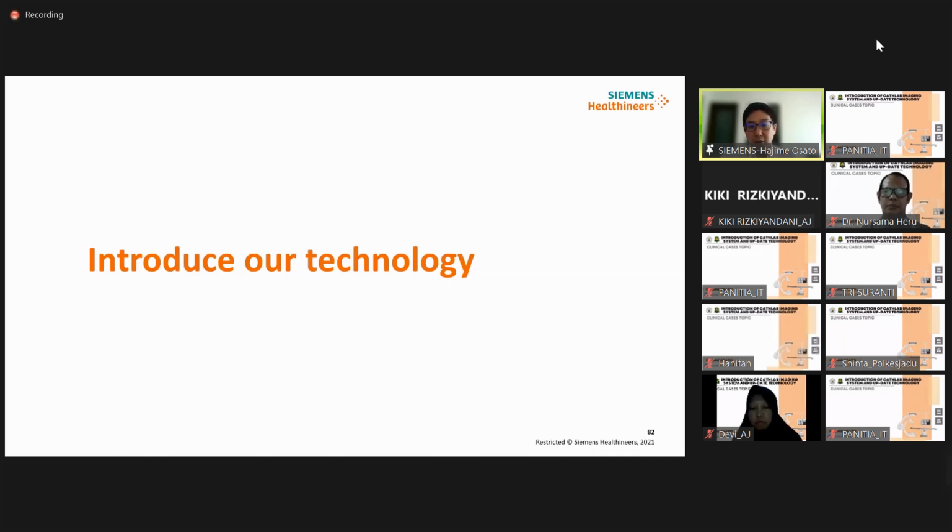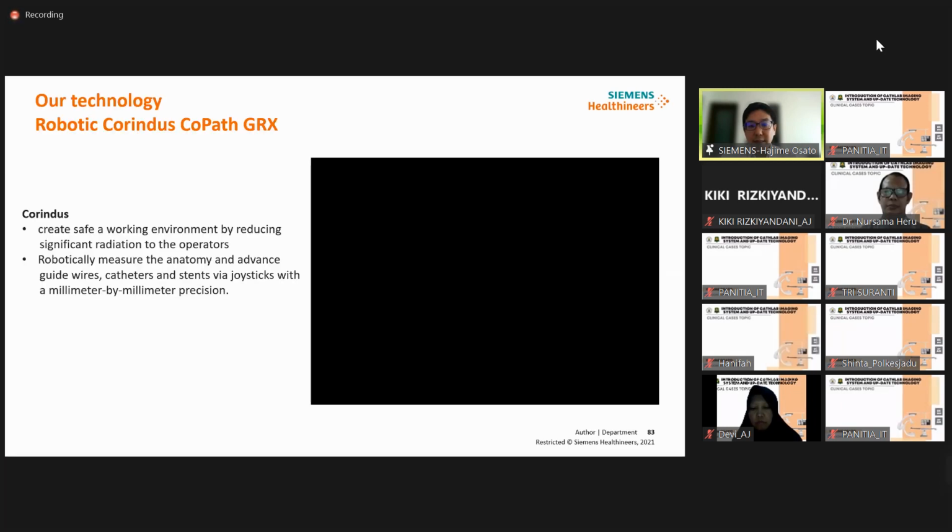Introducing our technology. In the last part, I introduced robotic intervention technology. It is called Corindus Corpath GRX. This system is set at the table side, and the operator controls the system remotely via joystick. It makes a new, safer working environment by reducing significant radiation dose for the operator. So I will share this video.